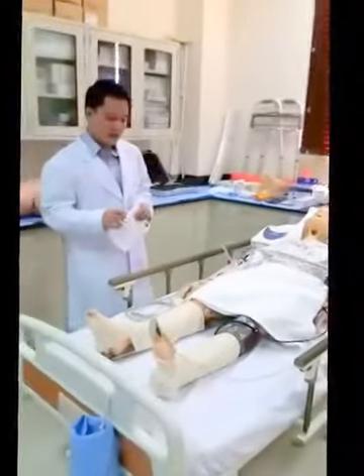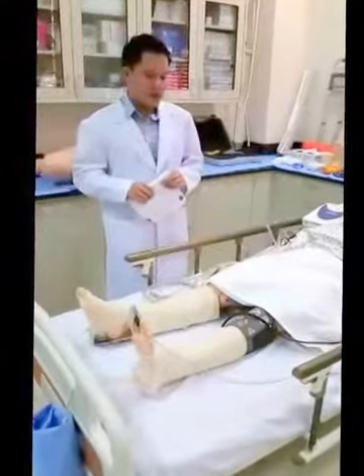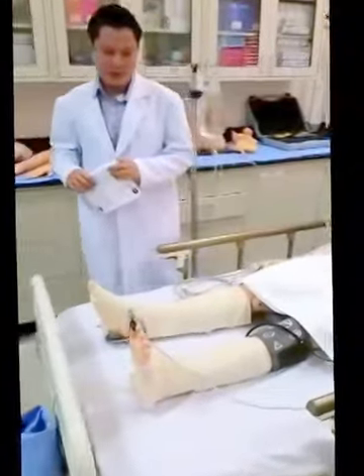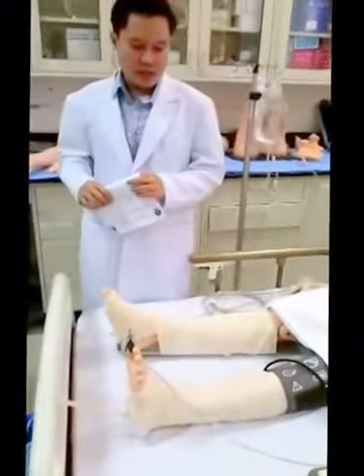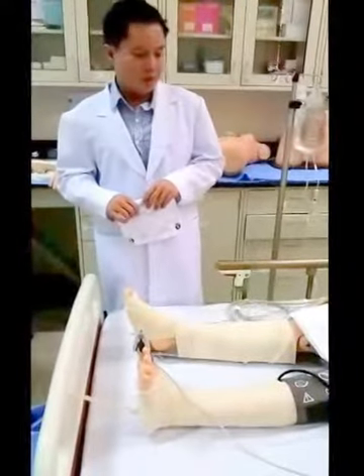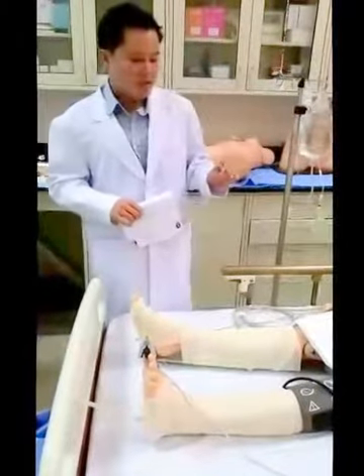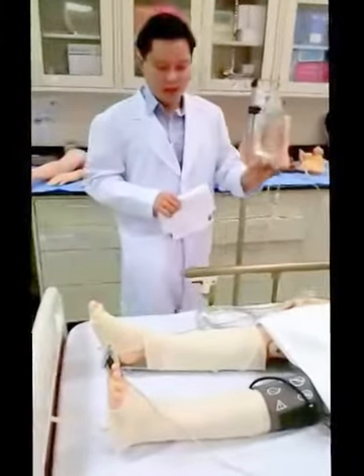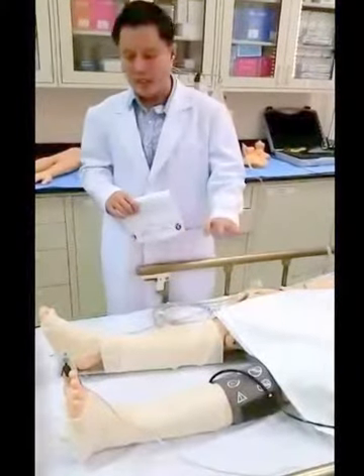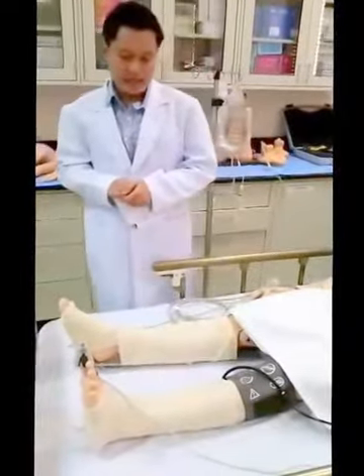Patient with skin traction. First, we will do the neurovascular assessment. How to check the neurovascular status of a patient with skin traction. Okay, so our patient here has a left femoral fracture, so he has this skin traction. So we will do the neurovascular assessment.